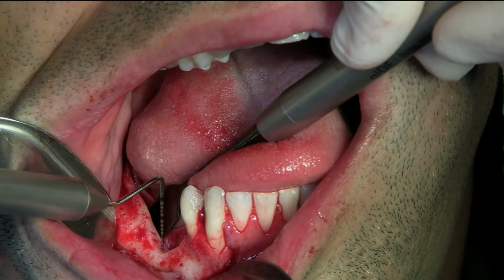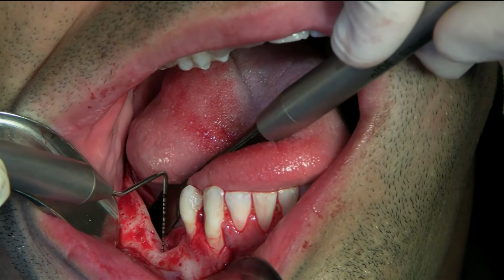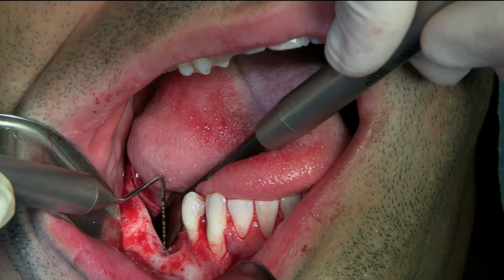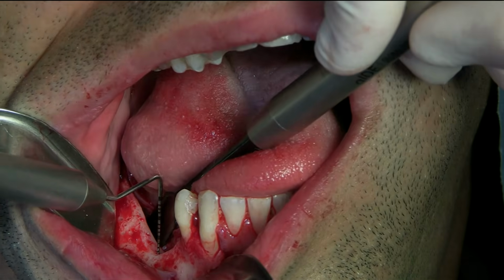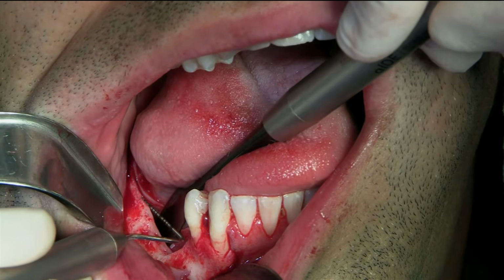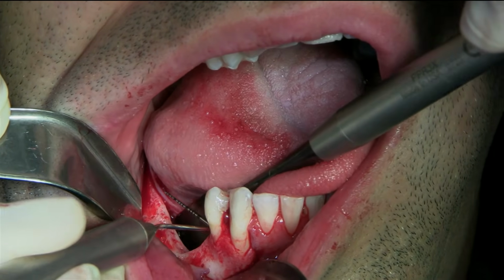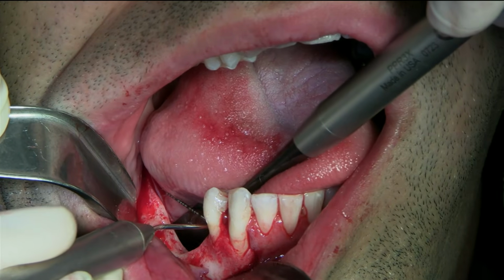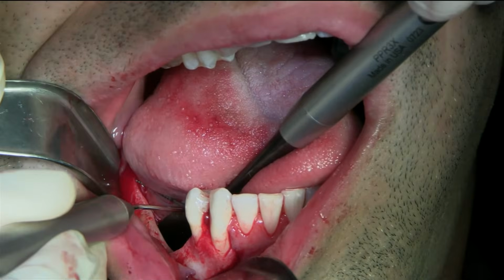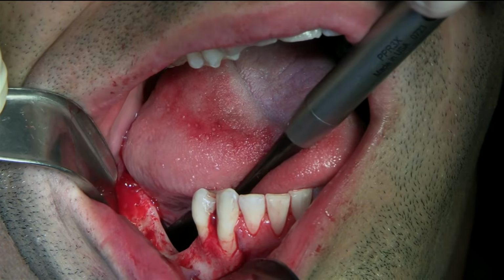So you're looking here, that's quite extensive. If you look from 5 to 10, it looks like almost a 10 millimeter defect from the anterior bony peak to the posterior, a little bit less. So the bone level will go from super high anteriorly to moderate in the back. We're going to go with something like this. I'm not going to try to regenerate more bone on the posterior. I'm just going to fill in this void that he has.